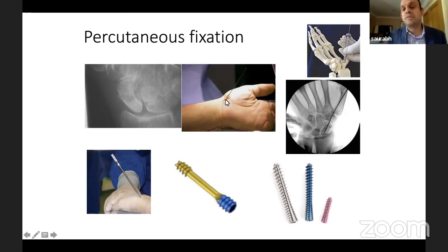This is a bit too big an incision, but something like that, like 6 to 10 millimeters. And then your screw goes in, basically, and that's it. Other question here, that's why I put these screws on this slide. Another thing to remember is whatever you measure, take 4 less. That's important because you will be causing some compression here.